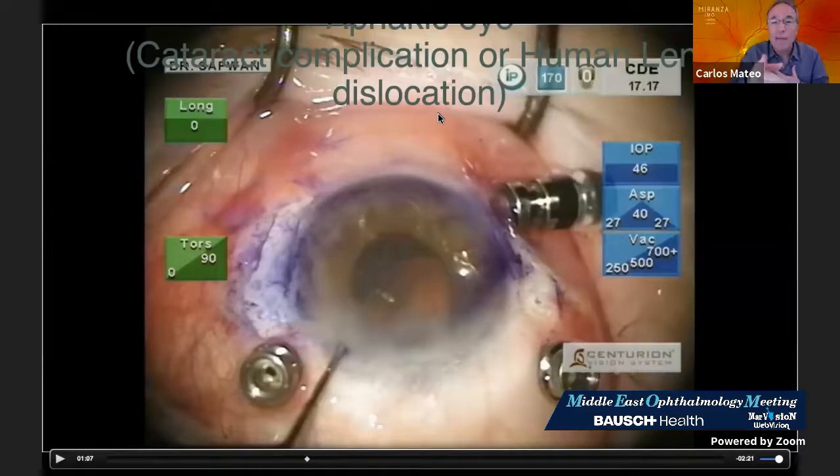When I have to do Yamane, as Brian mentioned, and the last optical part, then I use the MST with an anterior opening in the corneoscleral opening. I use the MST forceps to put the second haptic in the needle.